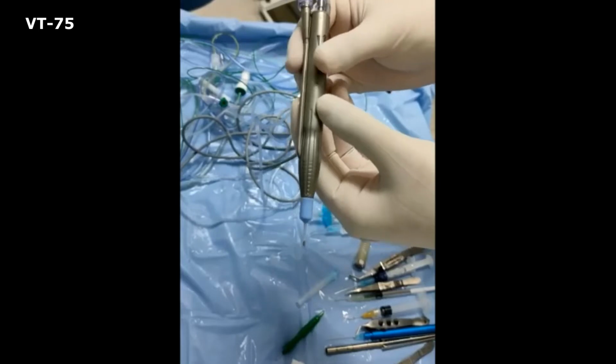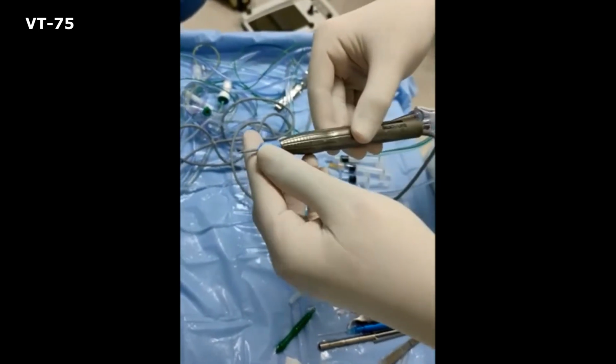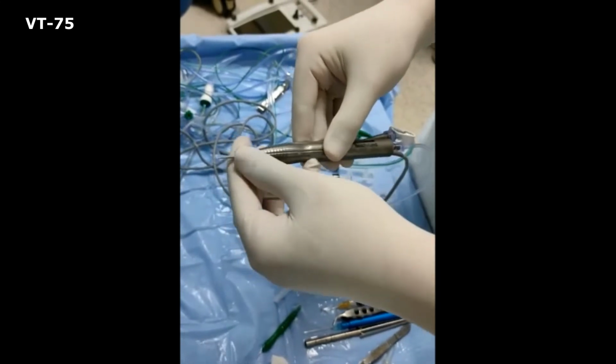Now the same phaco probe was used by removing the sleeve of the tip and disconnecting the irrigating line.